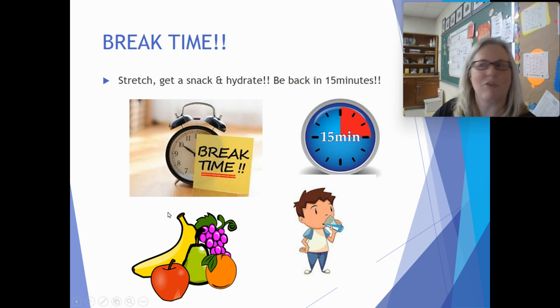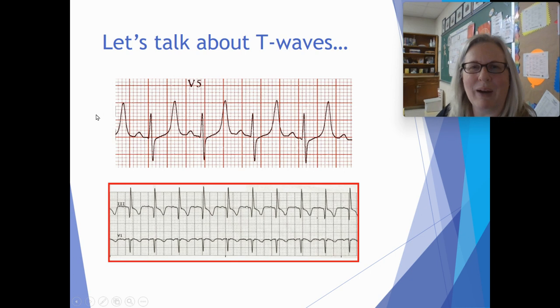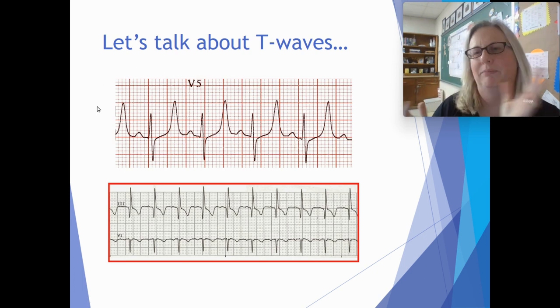So welcome back if you came back. If you took your pause and break, welcome back. Here we are. Let's talk about T waves. We are back for T waves, okay? We learned about peak T's and inverted T's last class. What about them? Let's see.